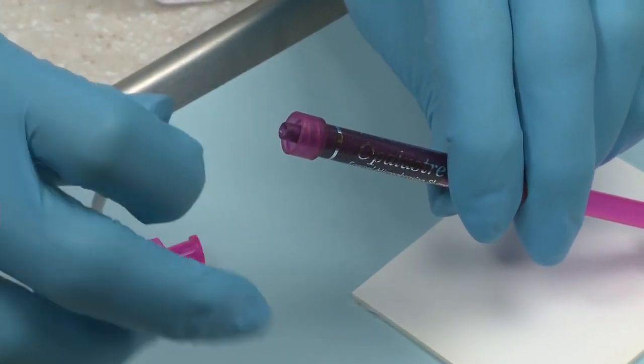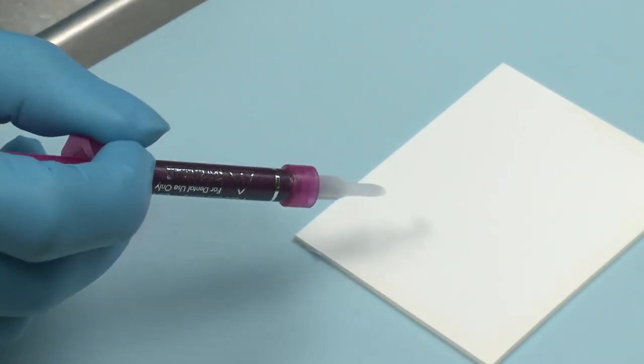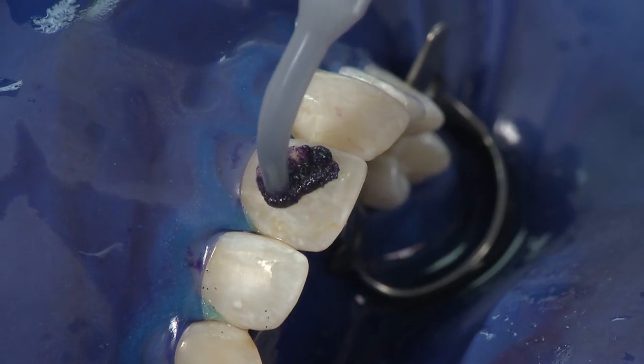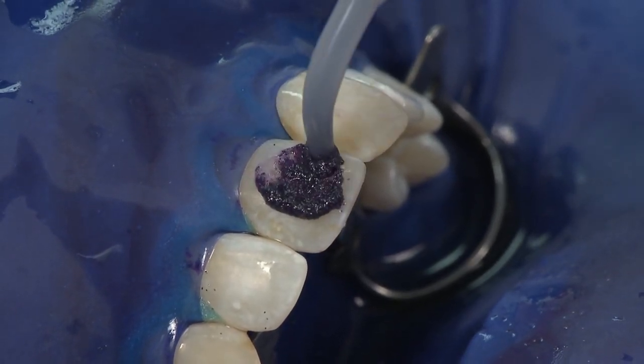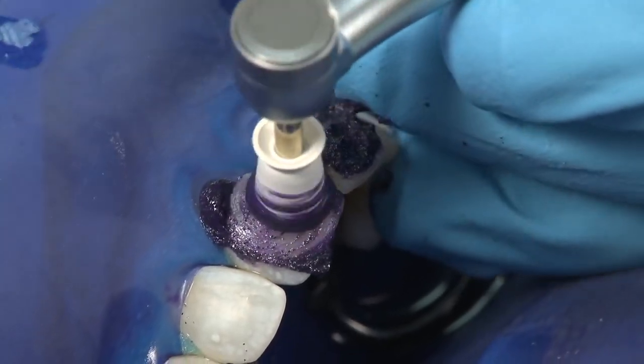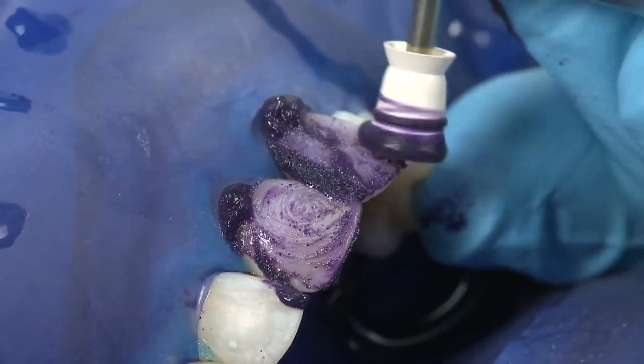When applying Opal Luster, remove the Lurelock cap from the Opal Luster syringe and securely attach the white MAC tip. Verify flow prior to intraoral placement. Apply approximately a 1 mm thick layer over the discolored area. Using a rubber profi cup at a slow RPM, apply medium to heavy pressure for 60 seconds at a time.